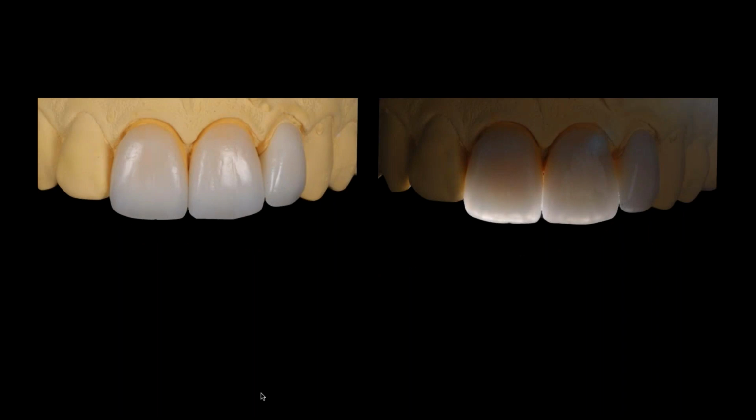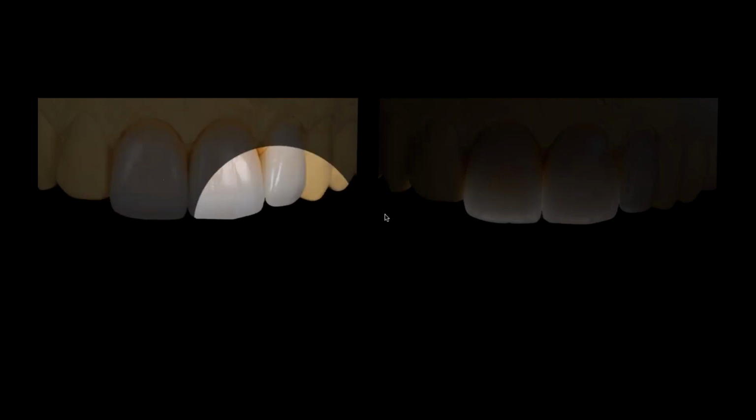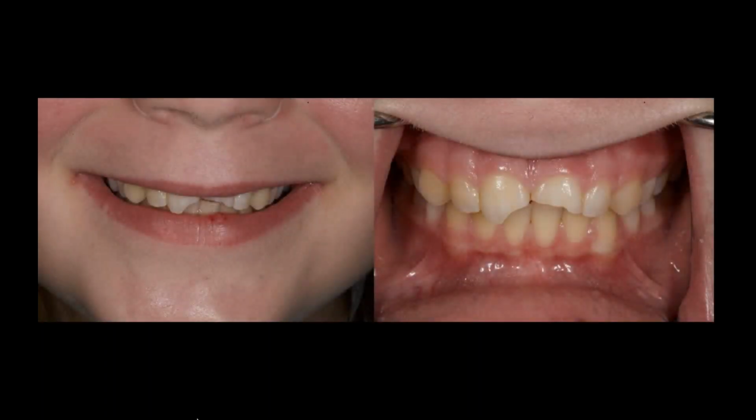at that point, because really the key was just to replace what was missing from that top half of the tooth. And if you look to the right of your screen, you'll notice light transmission-wise, how well that kind of works, right? Because one tooth I have only maybe 2.5 millimeters of restorative, where the other tooth I have 5 millimeters of restorative. And I'm managing the light to be the same because of the opacity on the internal aspect, not because of how much translucency or other materials I'm putting on the outside. That's why I said I wanted to focus on the opacity.